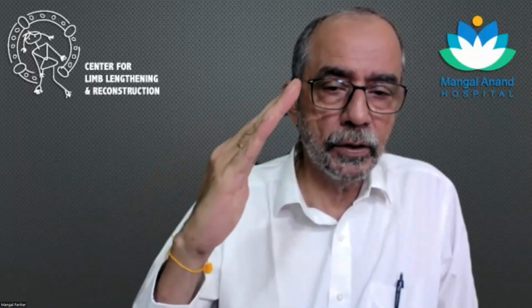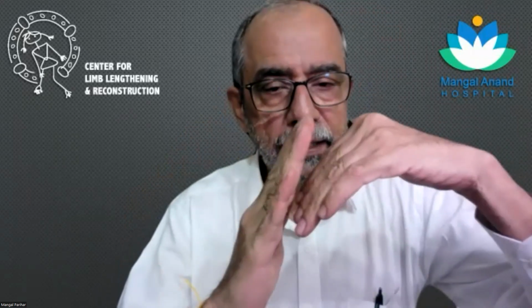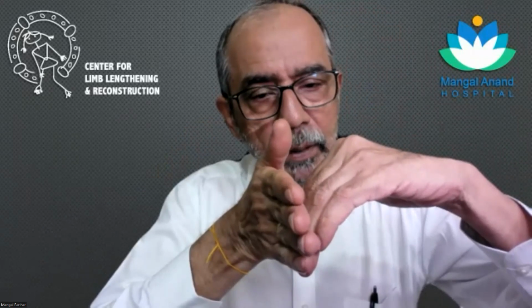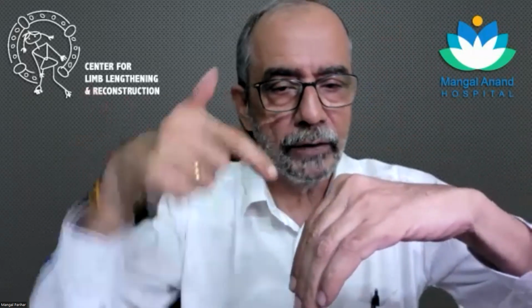But what Milind is talking about, I don't know whether you're able to see, the tibia is like this, and then the plate, to get it lateral, you have to fix the plate a little bit like this, so that your screws go more medial lateral and not as posterior.